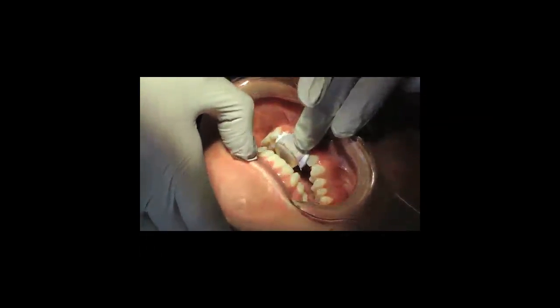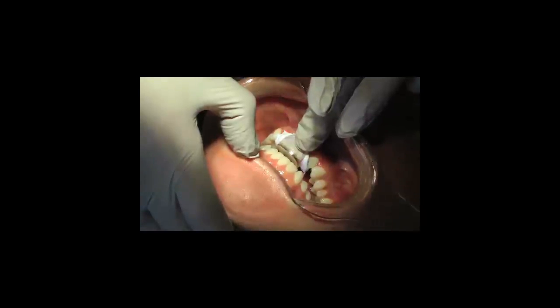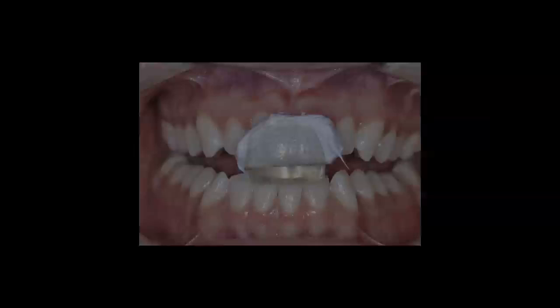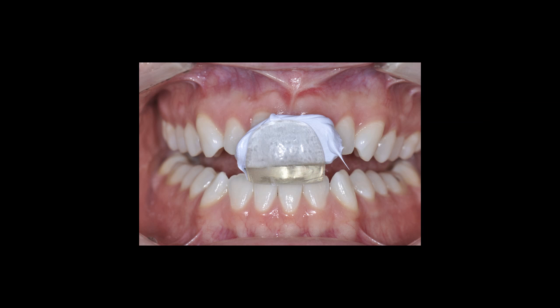I'm going to have the patient seat the Lucia jig so that we get that parallel or flat plane on their incisors, but I hold the labial so it does not tip in an AP direction. And then we just allow the material to set.